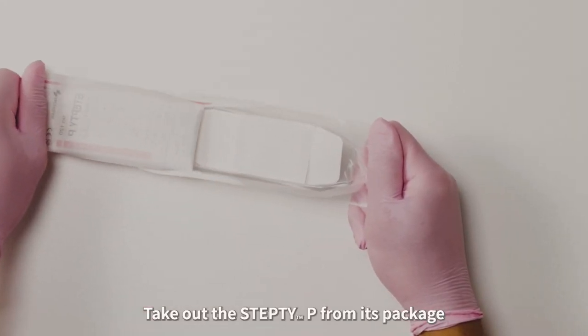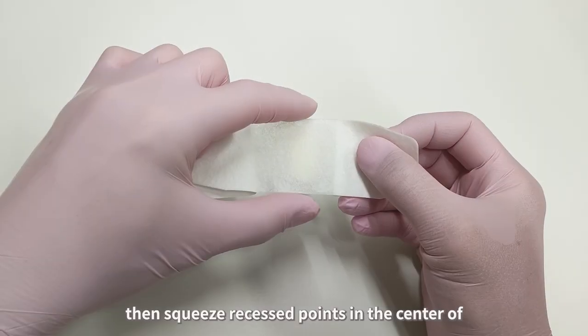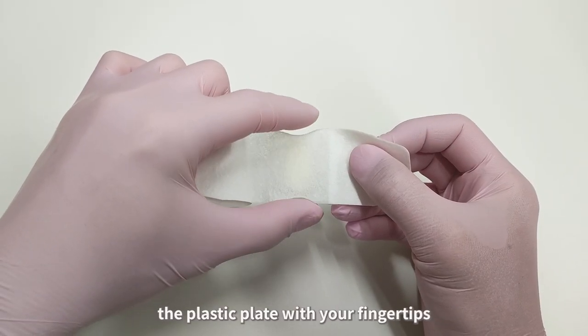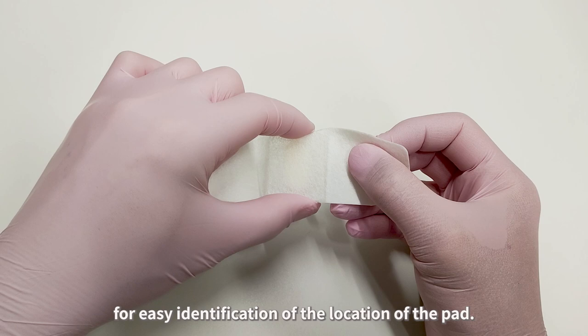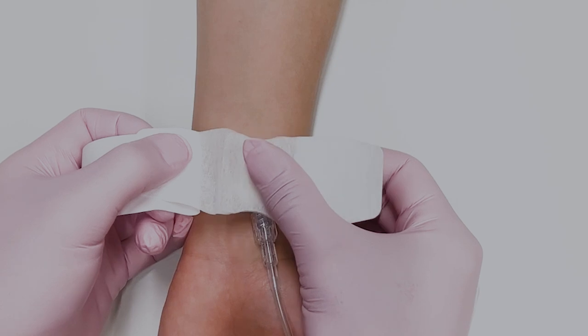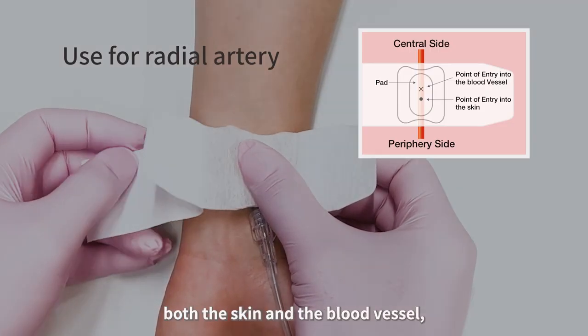Take out the STEPTY P from its package. Then squeeze the recessed points in the center of the plastic plate with your fingertips for easy identification of the location of the pad. Place the pad so that it covers the point of entry into both the skin and the blood vessel.